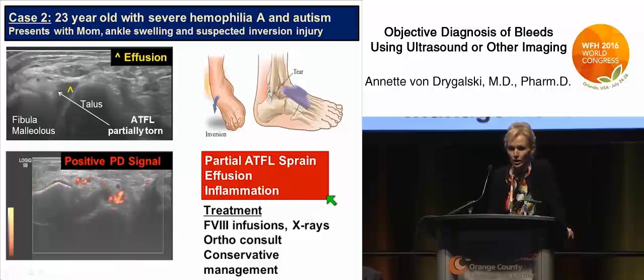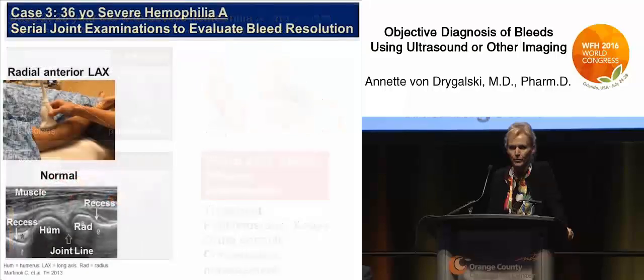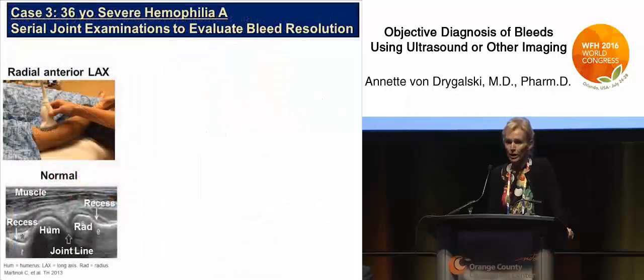We obviously subjected him to factor VIII infusions, but then he also got x-rays, an orthopedic consult to look for other possible fractures that can be associated with this type of injury. And then we decided to do conservative management, mostly physical therapy appropriate for this type of injury. And case 3 will illustrate how you can use the ultrasound to follow your patients after bleeding episodes.